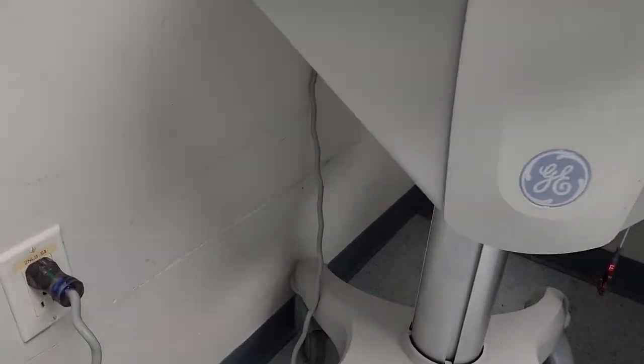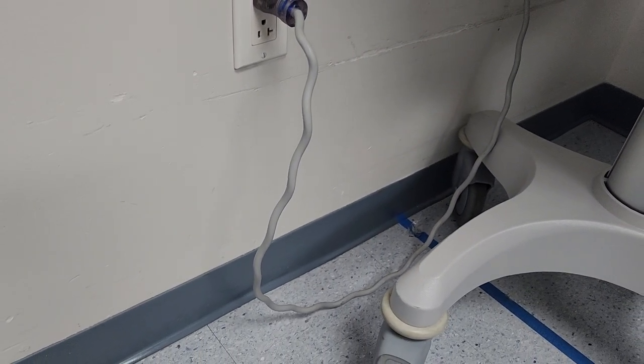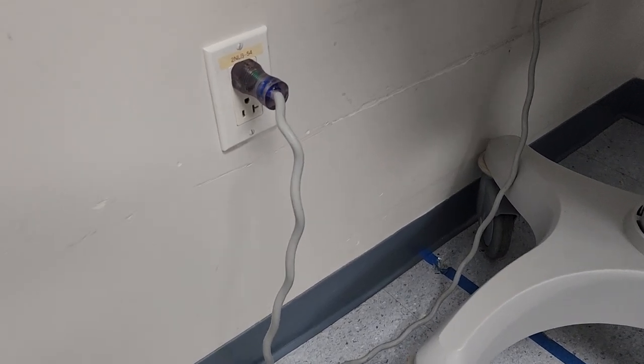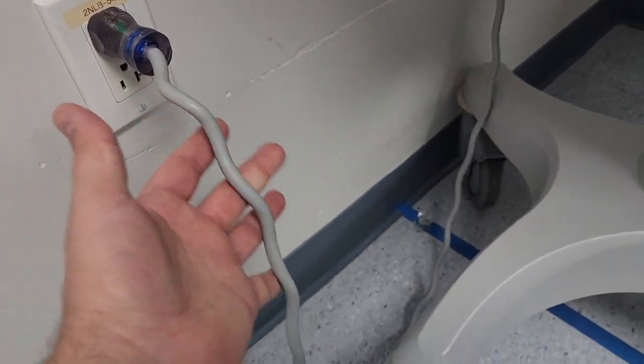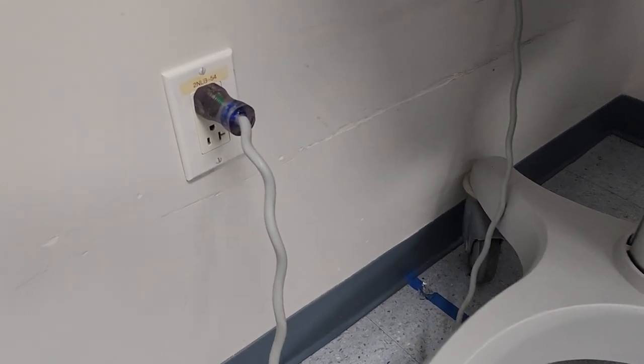You see this here? If you guys have a piece of equipment that's got a cord that looks like this, you should schedule to have it replaced. This cord here has got the conductors wound inside it, and that means that they're being stressed and they're going to break.